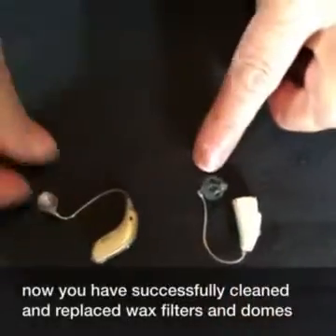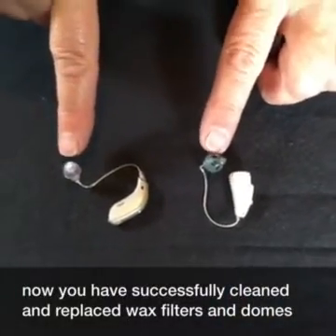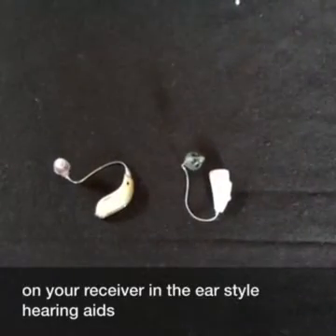And now you have successfully cleaned and replaced wax filters and domes on your receiver in the ear style hearing aids.